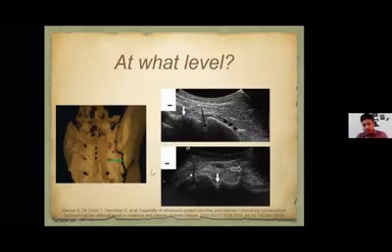And one very important thing here is that when you are doing it at a superior level, the ilium is a little tilted towards the medial side. So you need to move your needle medial to lateral. While if you're doing it on a little inferior side, like at the S2 foramen, it will be vertical. So you can go directly. A little bit of medial to lateral will be required, but not that much, right?